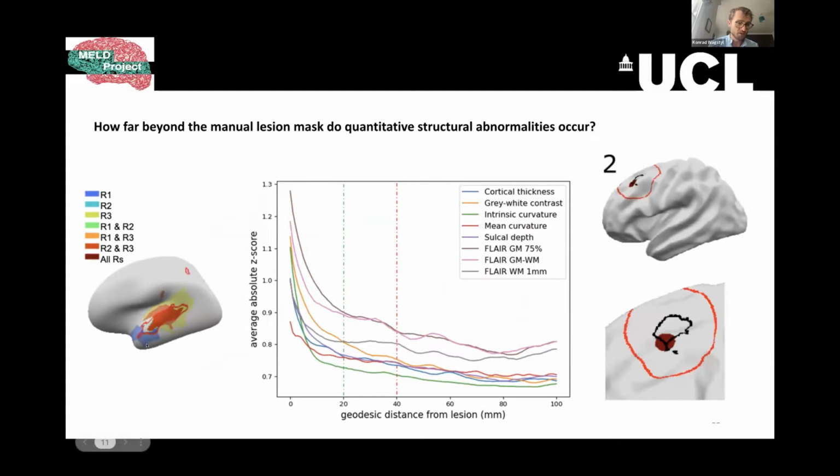So the blue mask almost doesn't overlap at all with the red and yellow masks. And what this means is when you're training a classifier, how do you deal with this? And also, how do you deal with a prediction that doesn't quite overlap where the lesion mask is, but is in the right area? And we also see this pattern emerging in the entire 600 patient cohort.